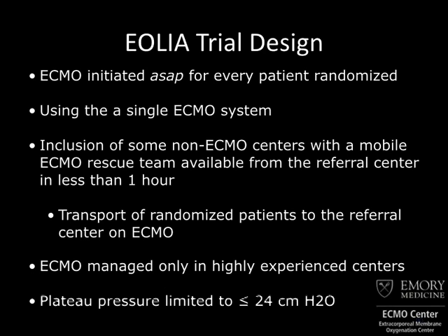And then last but not least, only highly experienced centers that are doing greater than 30 cases a year are going to be allowed to enroll. We were looking at enrolling for them until it got closed in the US because of the FDA. And last but not least, they're going to really limit the plateau pressures on these patients to provide what's termed lung rest.